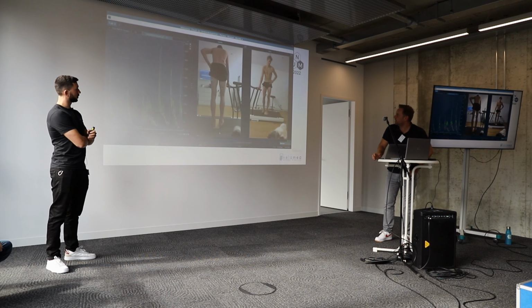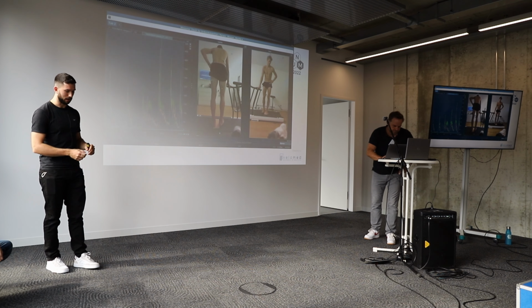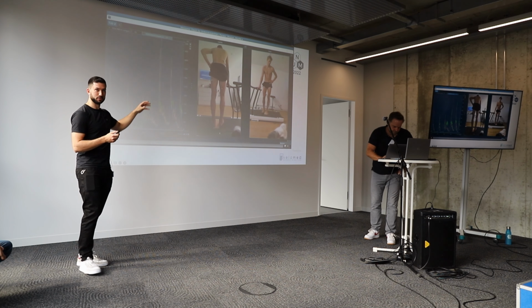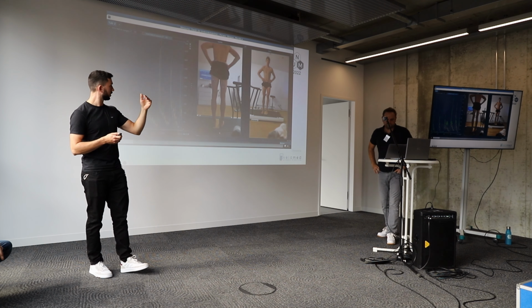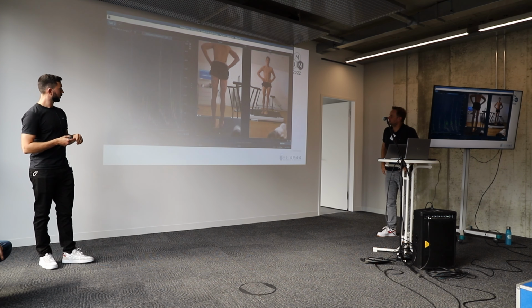So and this was 2 days after he had the task how to train the muscle, while in our biofeedback training, while he sees this muscle activity, he got the feeling how to do it.